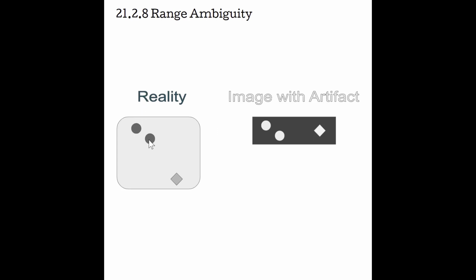So the sound is going to interact with these reflectors just fine and it's going to display them. The issue is that the sound is still going to propagate through. Typically it propagates through until it attenuates and it's going to continue sending reflections back. Now most of the time we have enough depth so that our PRP and our PRF all match up and we're doing a very good job at imaging and having attenuation occur, so we're getting the real pictures.